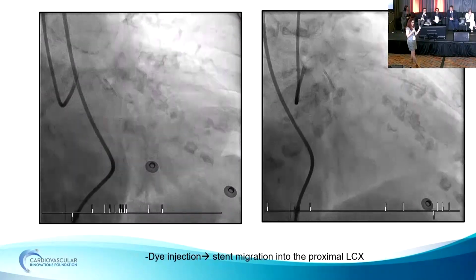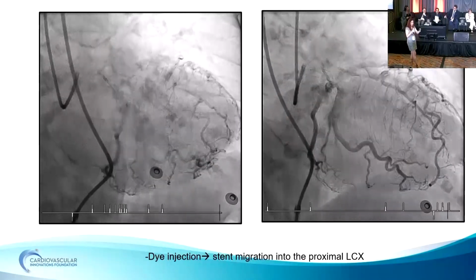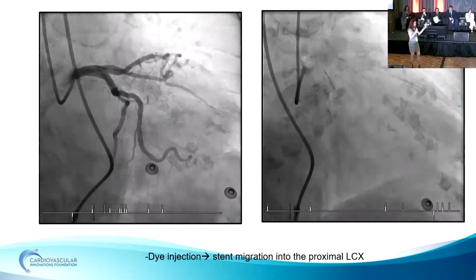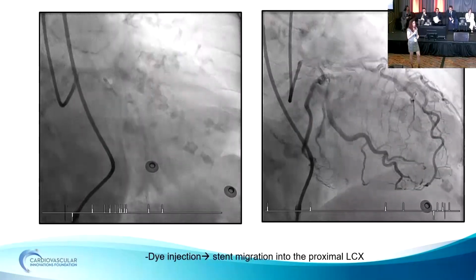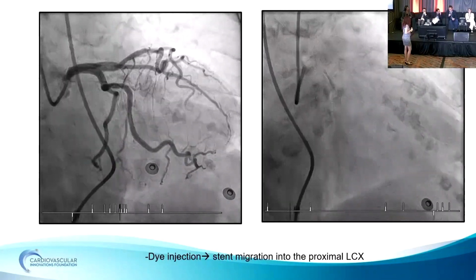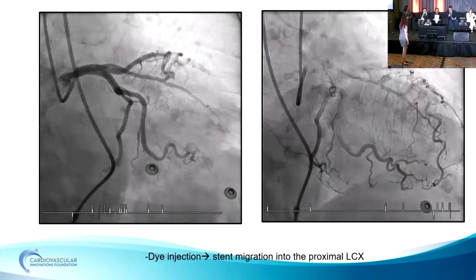So it's very interesting, it went from the ostial RCA into the cusp, jumps into the left cusp, and then it's in the left circumflex. So now, I'm happy that it's not outside floating and we haven't lost it. It's in a big vessel. Now what do you do? Maybe just stent it right here, or what would you do? Circ looks easier to manage than the right. Yeah. And it's good it embolized into something we know how to manage rather than the brain.